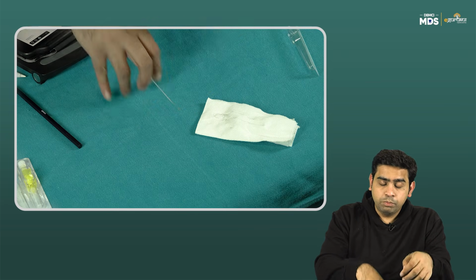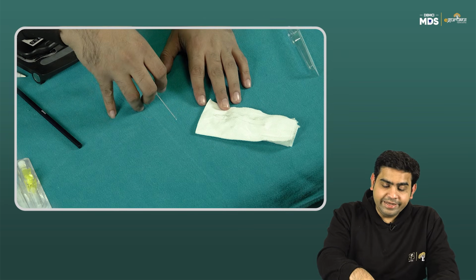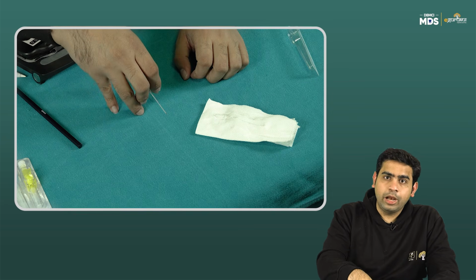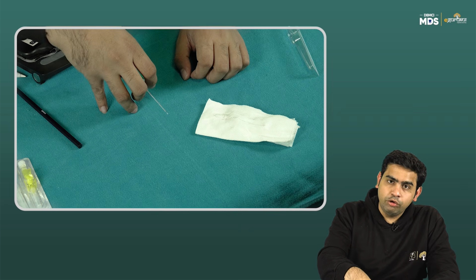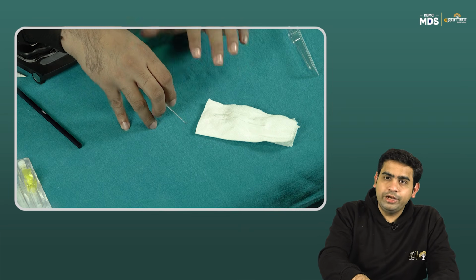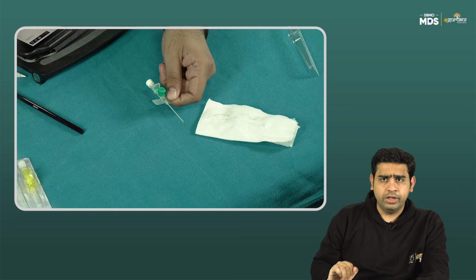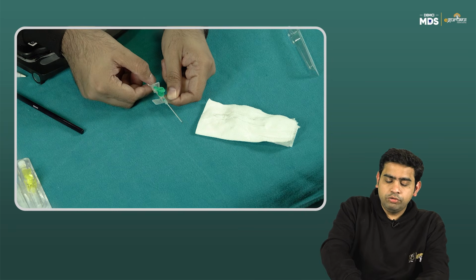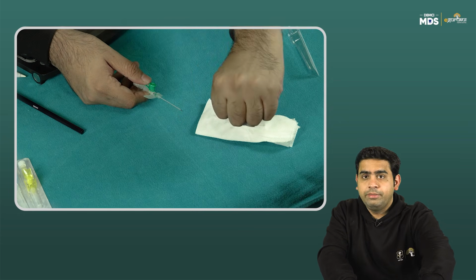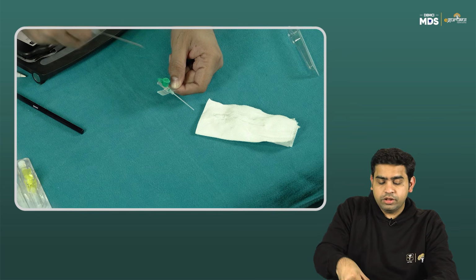Once you want to put this IV cannula into any person, you gain entry into the vessel. You do not want to counter puncture that vessel, so you just gain entry into that lumen and then try to be parallel. You go in. Once you are adequately inside that vessel, the blood will come over here and now you know that you are inside. Before removing this, compress the arm distally, because if you don't, once you remove this needle, the blood will start to come from here.